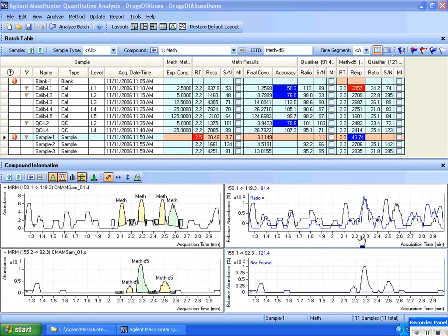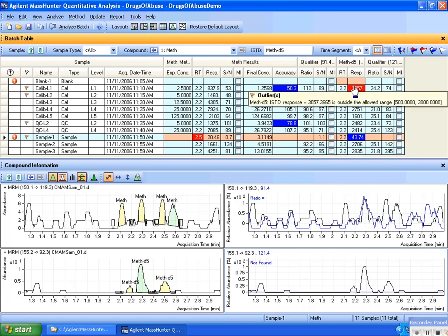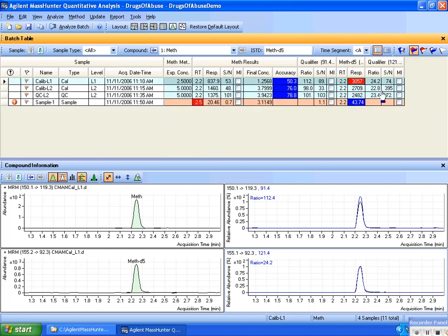Now that I have reanalyzed with the new method that contains the outlier turned on and the metrics set, you'll notice that for this particular sample here, I'm being told now that the ISTD response is too low for those limits. And also, as I go up to calibration level 1, I'll notice that also that particular sample gave an ISTD response that's slightly larger than the expected 3,000 limit. So that gives you an expectation of how to use outliers to zoom in on problem samples and help you get through analyzing a large batch.